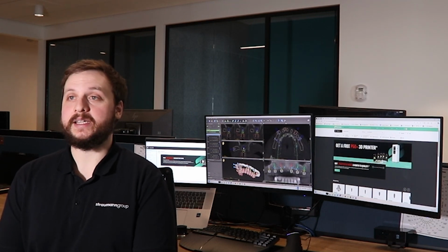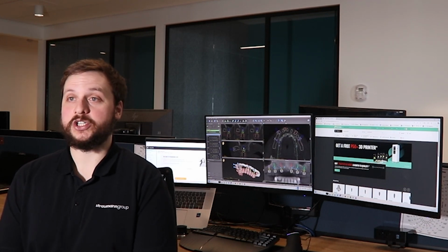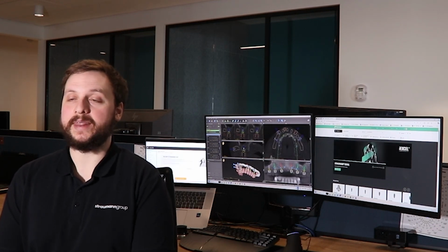Pictures help us to validate the position of the midline, to set the occlusion plane, and to select the proper shape and size of the teeth. We can of course design a wax-up without pictures, but the quality of the outcome will be improved if we get them.